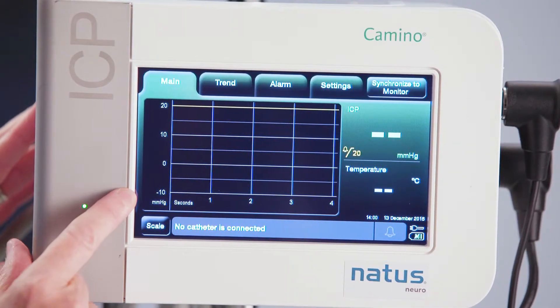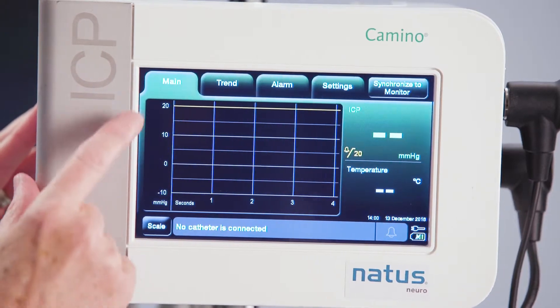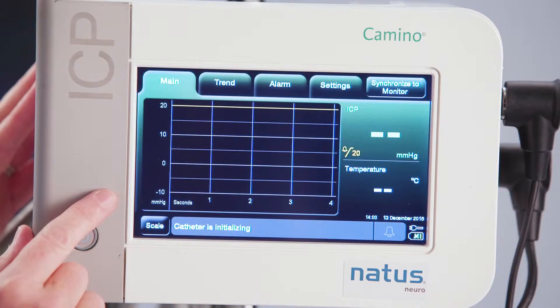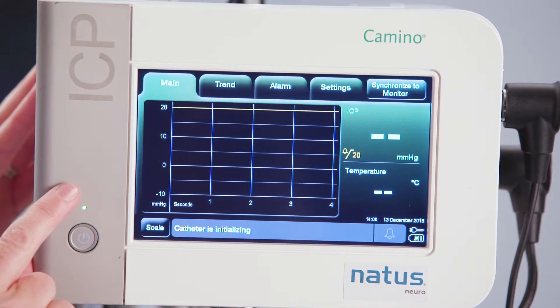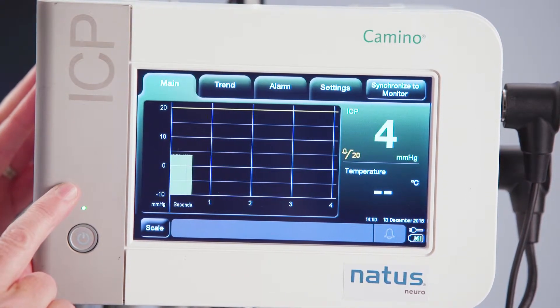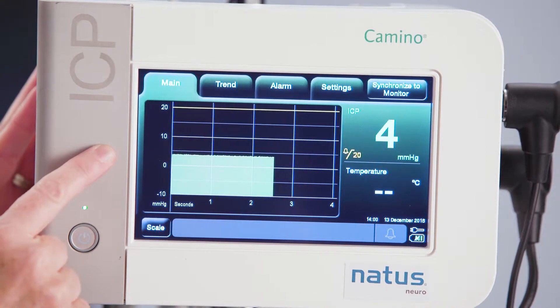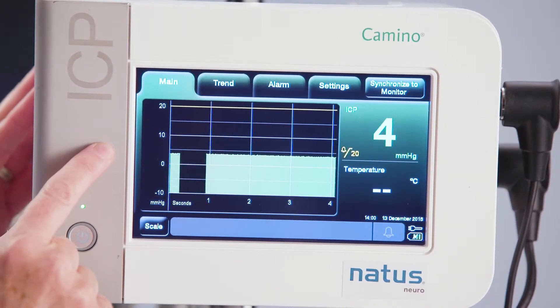Right now my scale is set at negative 10 to 20. So if my patient's ICP is within that range, then that's exactly the scale I want to be at. I'm going to attach a catheter here so we can see what that looks like. It's telling you the catheter is initializing, and here's my ICP value showing up at four. But if my patient's ICP was much higher than that, I would need to change my scale.